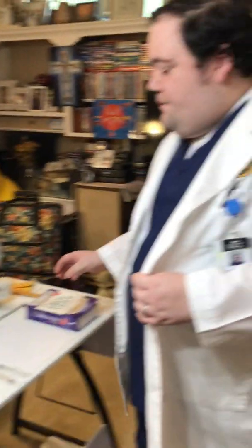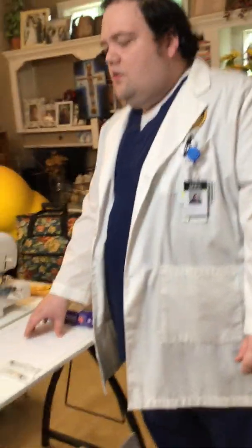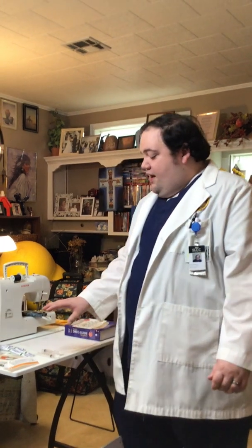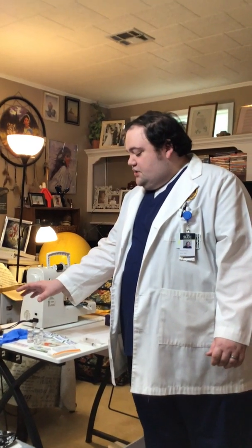All right, now what we have here, we have our medication order, or MAR, whichever one you may have. We have our Davis's Drug Guide for Nurses, 16th edition from F.A. Davis. We have various sized syringes and needles. We have our demo dose vials, medications, PPE. We have our bandages and supplies. So, with that being said, let's begin.